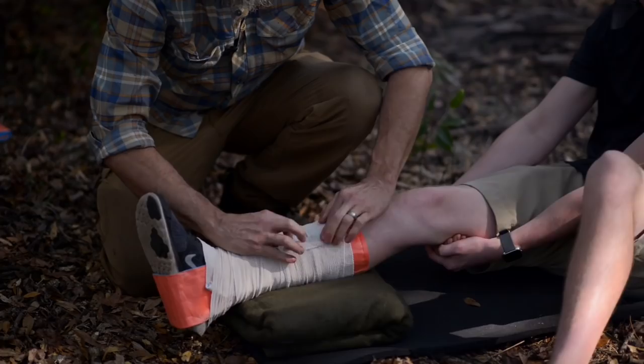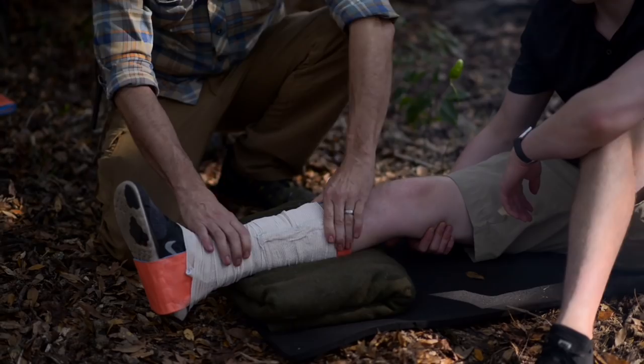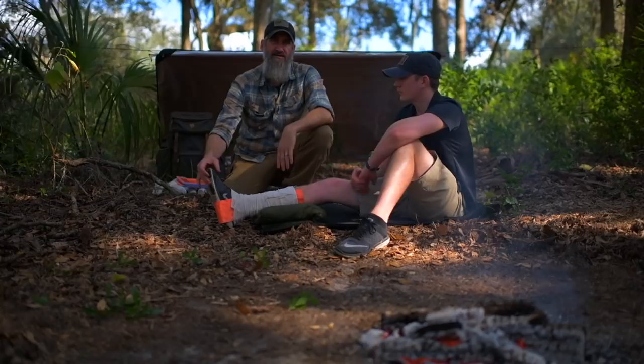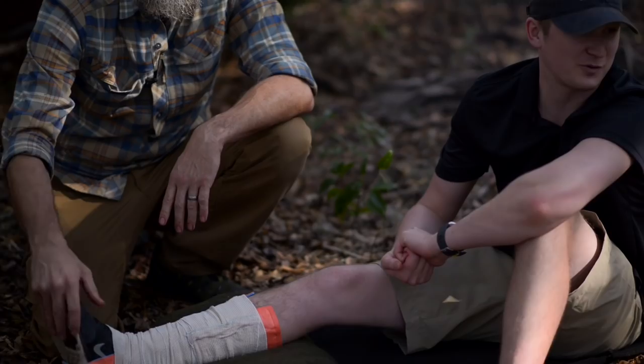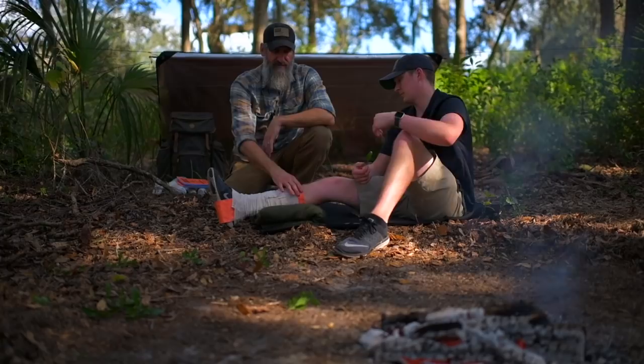Go ahead and lower that down. Secure that bandage off and take a look at your work — see if there's anything that needs to be adjusted. And of course, recheck your CMS because we've put an intervention on. In this case I can't reach the pedal pulse anymore, and his footwear is still on because he needs to walk out, so I can't check capillary refill. But it's reasonable to believe that if he has motor function — go ahead and wiggle your toes — and if he has sensory function, then he still has circulation. Both sides of the foot — trick question. He still has motor function and sensory, so it's reasonable to expect he still has circulation. We can try to walk out with this simple ankle stirrup made from a SAM splint.